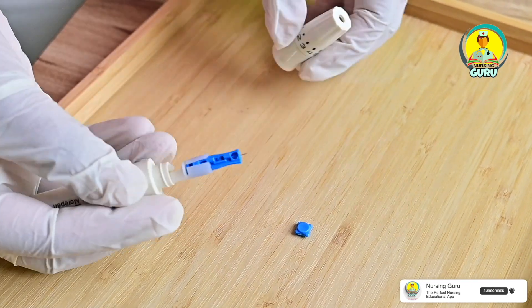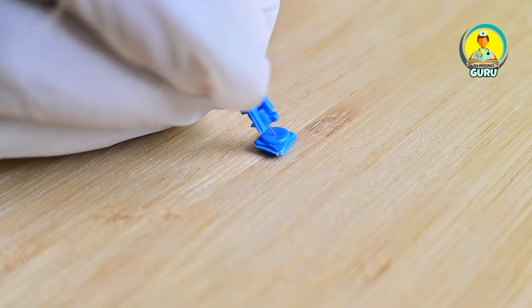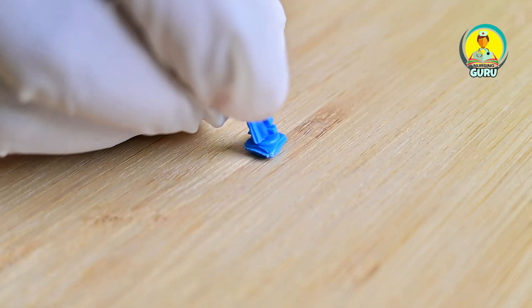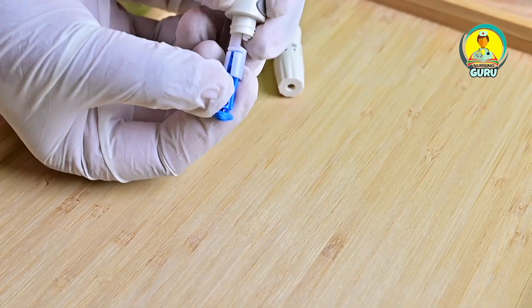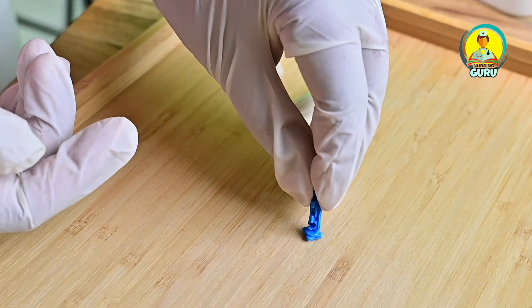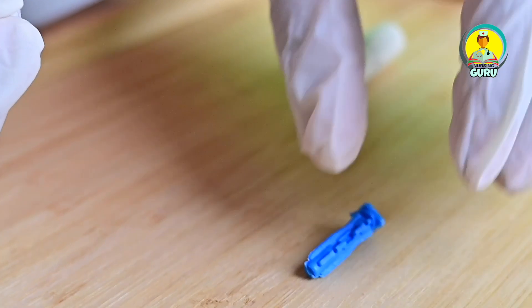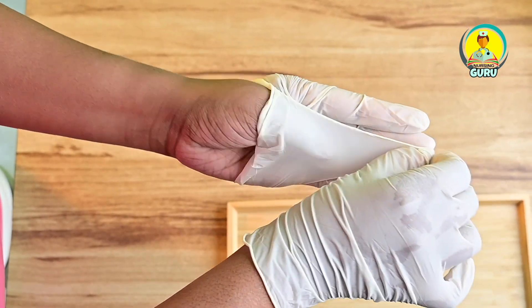This is the discarding method for the used lancet. Remove it from the lancing device — recapping is not recommended. Safely discard the lancet in a sharps container. Then remove your gloves and wash your hands.